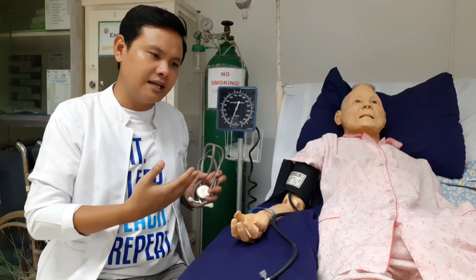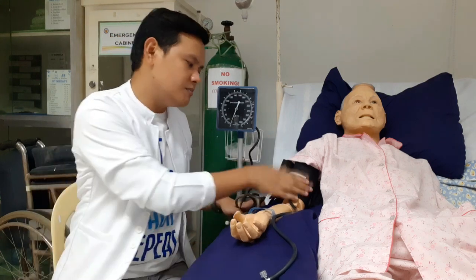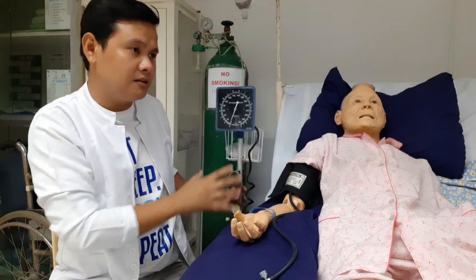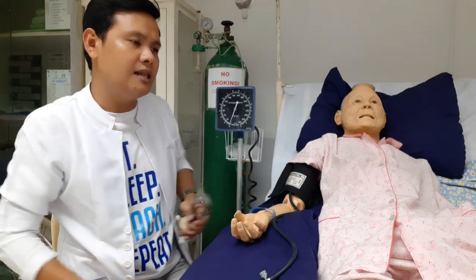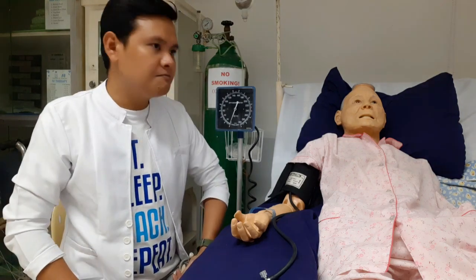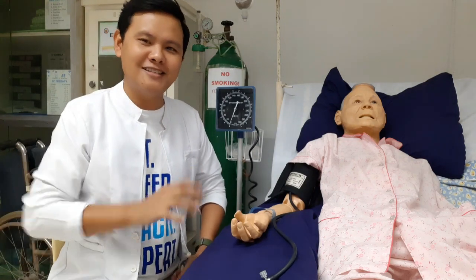Tanggalin natin lahat ng mga kailangan tanggalin sa may pasyente natin. The BP cuff, okay, the sphygmomanometer, or the BP apparatus, it's the BP apparatus in general. And then pumunta tayo rin sa may client po natin. Okay? So yeah, that concludes our discussion for the vital signs taking.